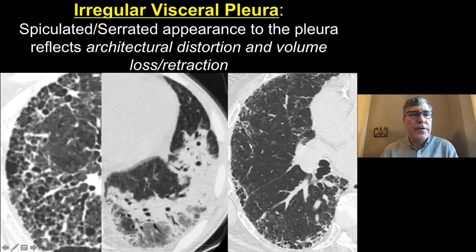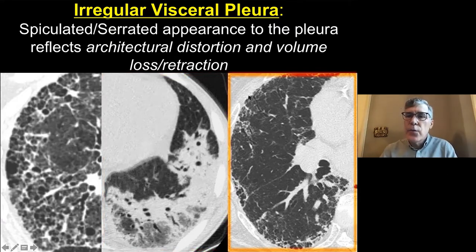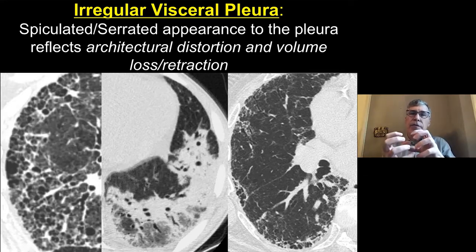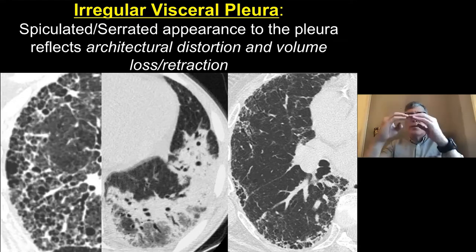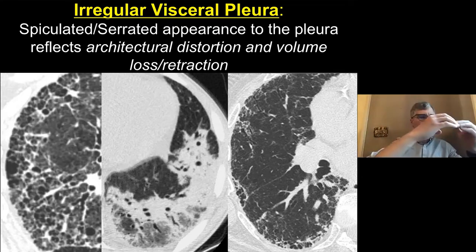Irregular visceral pleura is one of my favorites. The pleura should be nice and sharp. You can see a serrated appearance here — and another one with a little bit of serrated appearance indicating scarring. When you see this kind of serrated or irregular visceral pleura, the underlying parenchyma has evidence of fibrosis or scarring. It retracts and pulls the pleura, tugging it in and giving it that spiculated shape at various points.